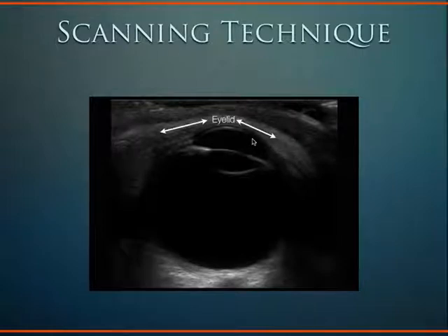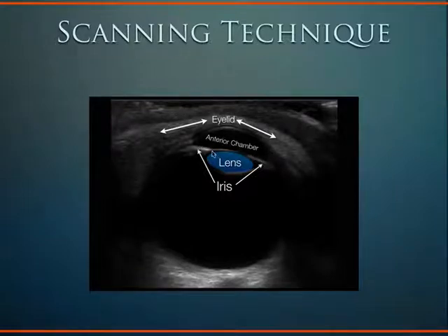And the various parts of the eye are outlined here. There's the anterior chamber. That's the lens. The iris you can appreciate here. In fact, where this iris comes together, the area here in the middle is the pupil. So it's not surprising that this pupil is quite dilated right now because the eyelid is closed. But if you shined light in the other eye that you weren't doing the ultrasound in, that was open, you would see contraction of this pupil.